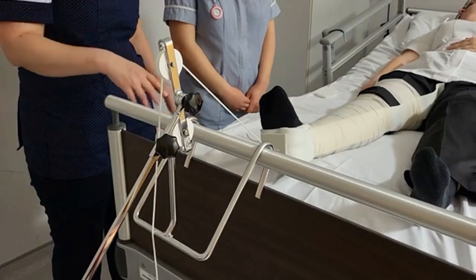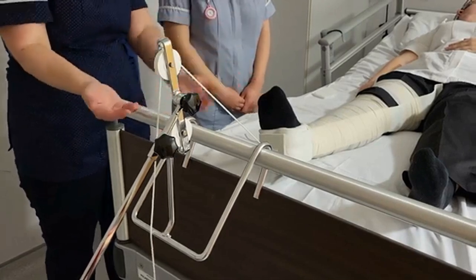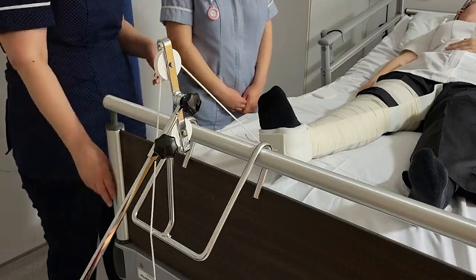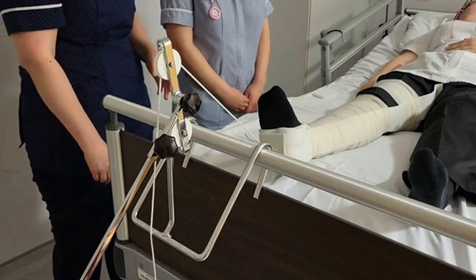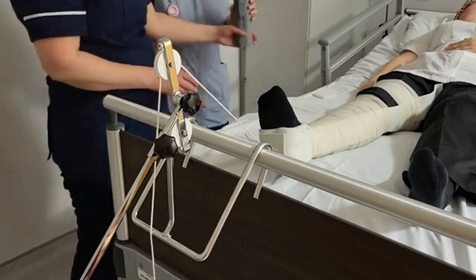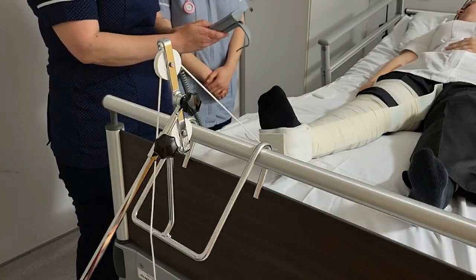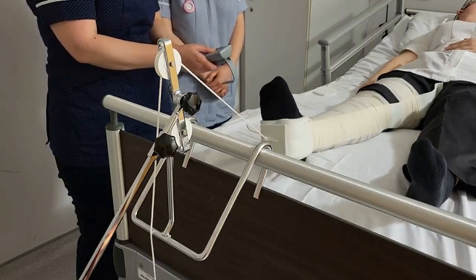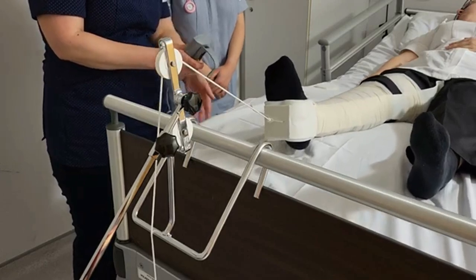The danger would be if the patient were left like this — she would slide down the bed, the weight would go onto the floor, and she'd be in a lot of pain because her leg would not be in traction. So we counterbalance that by putting the leg in counter-traction. If we have a suitable bed, we can tip the end of the bed up, which provides the counter-traction.